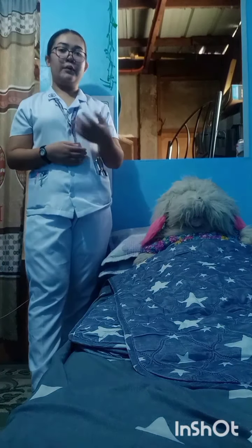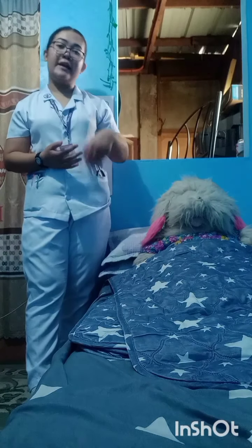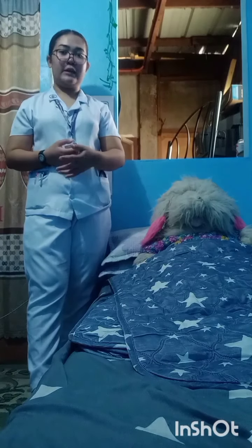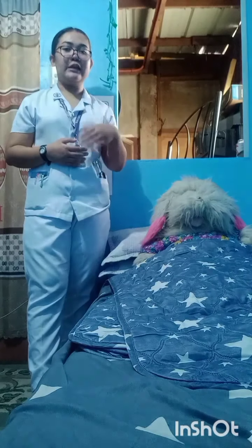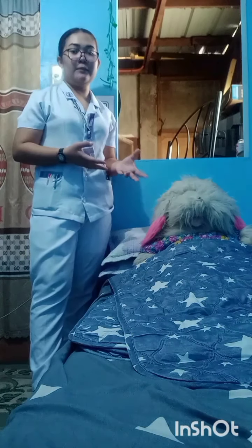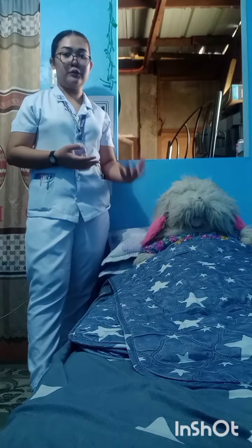Next is we're going to explain what we are going to do and why it is necessary and how he or she can participate in our procedure. Because explaining it to our client will give them assurance, and they can also participate because they already know what things or procedure we're going to do.